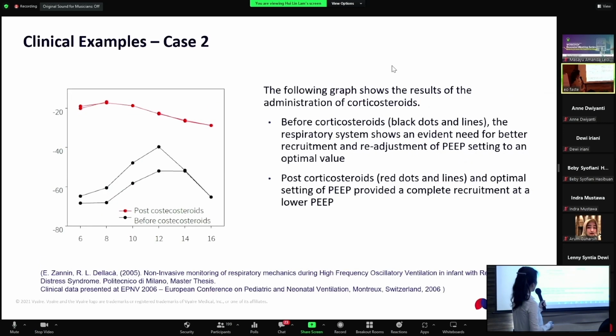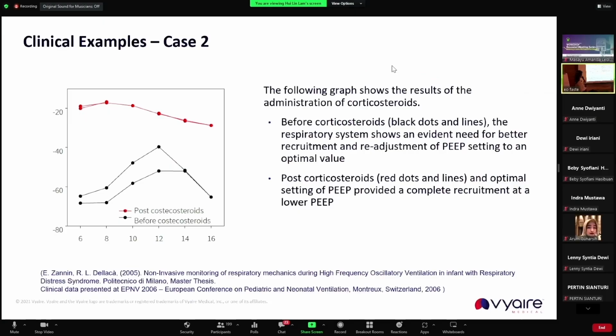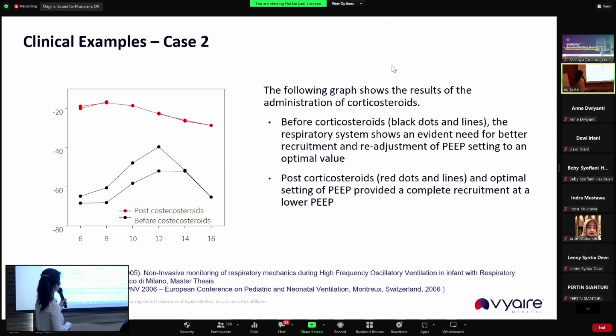And here is another example of how we can use FOT in our daily clinical life. There is this patient before we give steroids. You can see some dots showing that the patient's lungs are recruitable before that. As we increase the pressures, the PEEP, for the patient, it now goes to overdistension. We manage to open up the patient's lungs. And then as we back it up, if we want to set the optimal PEEP here, at how much?